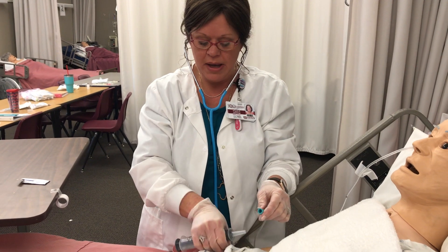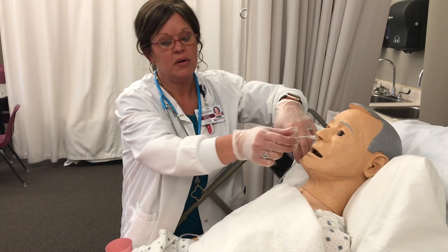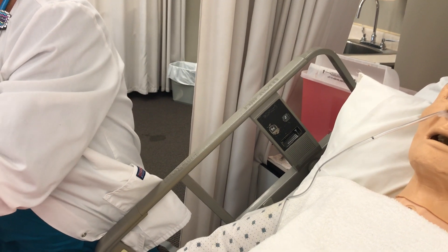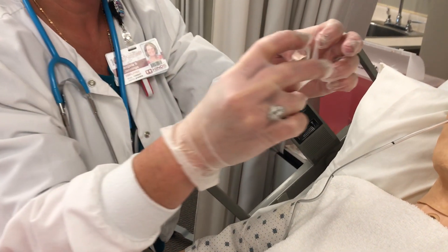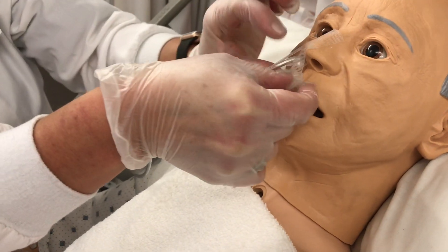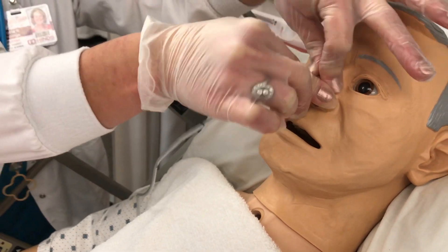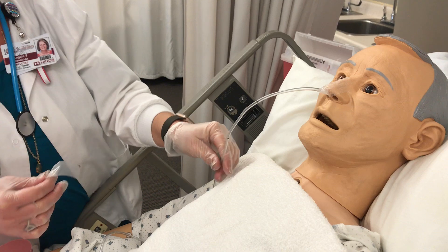I'm going to disconnect the syringe and put my stopper back on. Now that we know it's in the correct place, we are going to secure the tube to the patient. I always make a little strip of tape — this goes on the top of the client's nose and then you can secure it one on each side. This mannequin doesn't like to stick very well, but with a real patient you shouldn't have that problem. Now we have it secured in place, and my next step is to secure it to the side of the cheek.